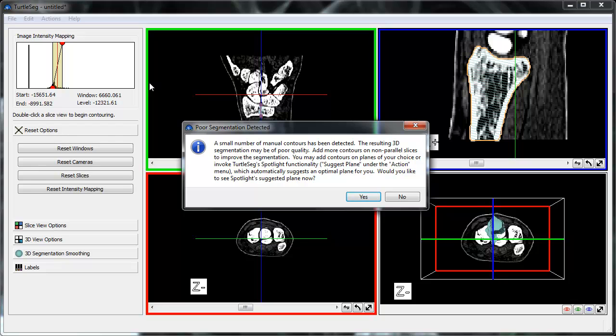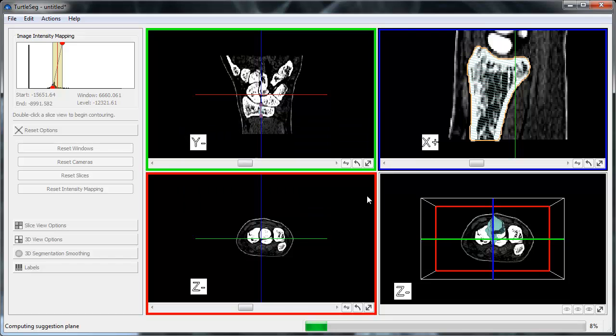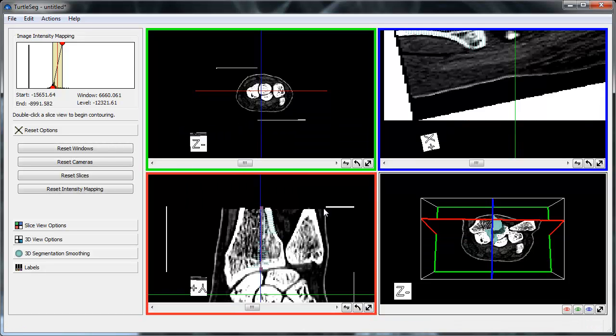The dialog suggests that we invoke TurtleSeg's Spotlight functionality to have it suggest a new 2D plane for us to manually contour, one that will improve the 3D segmentation the most. We click Yes, and TurtleSeg then calculates the best suggestion plane. The flashing border around the bottom left slice view indicates the suggested plane.